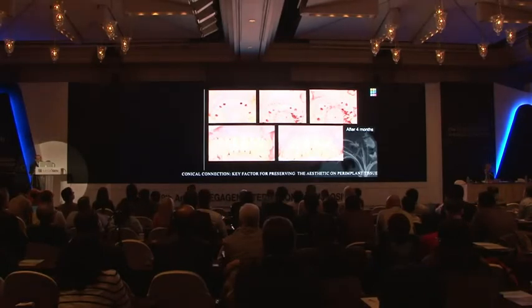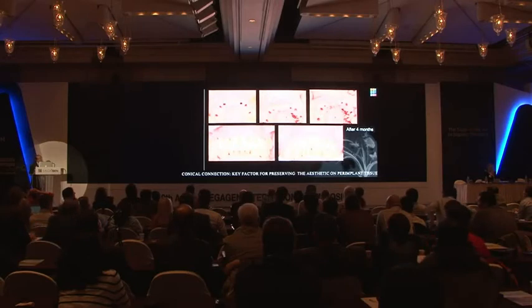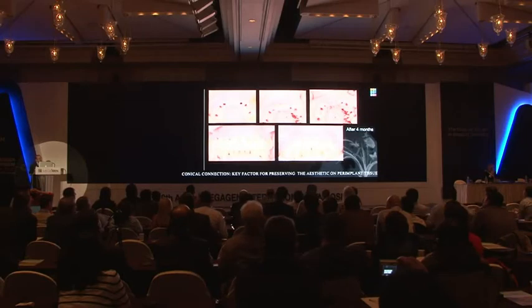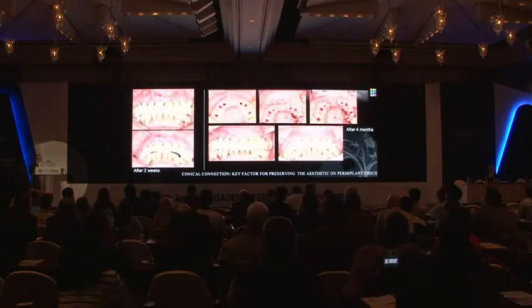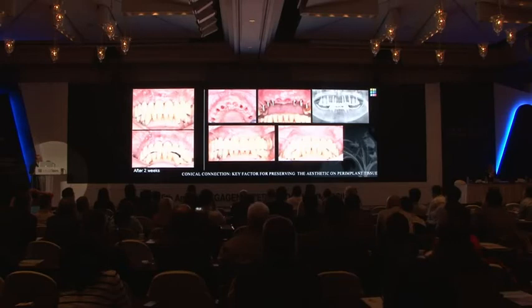Then we use a soft tissue graft to correct this deficiency in the mid area. We use an oval shape reduced provisional prosthesis for the soft tissue conditioning. And this is the reevaluation after 2 weeks on the left side, when we removed the sutures.